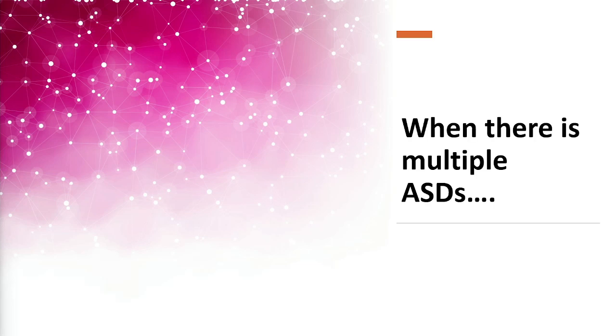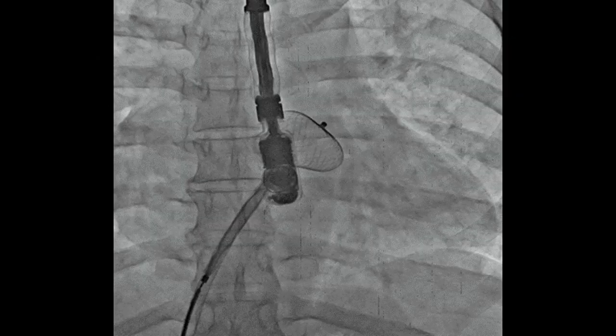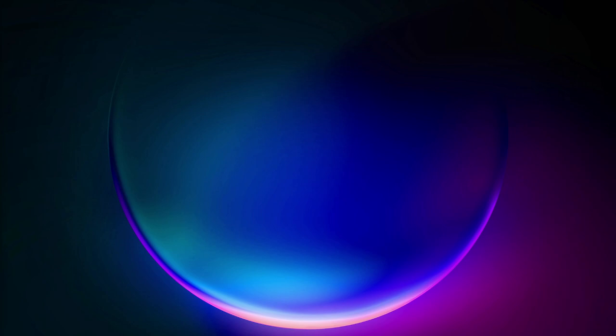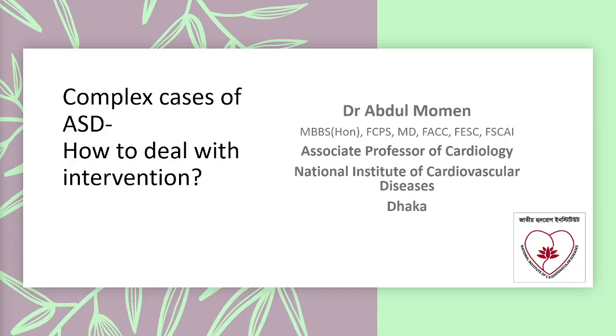When there is a multiple ASD, this multiple ASD was closed by a single device, but we can also close it by two devices. To cover by a single device, we have to show that the intervening tissue is less than nine millimeters, all the rims are adequate, and we have to pass through the larger ASD.